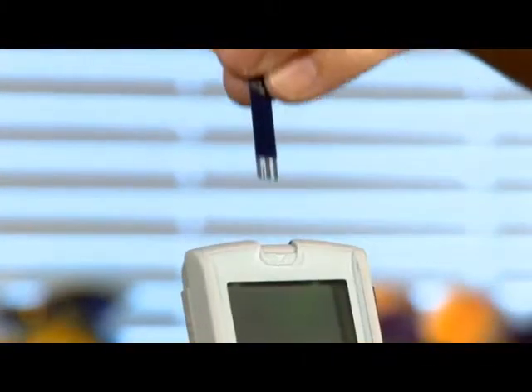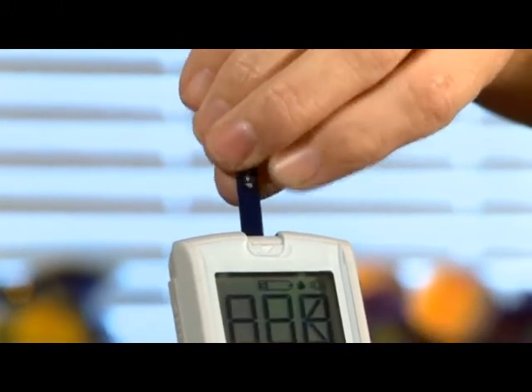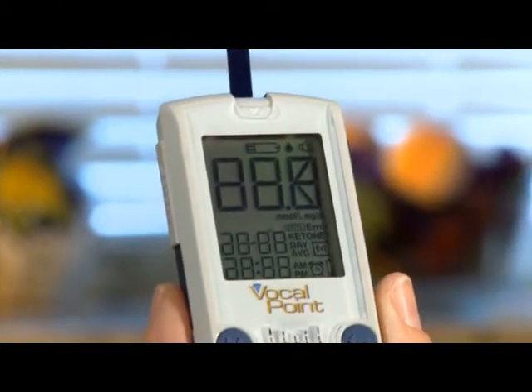Start by placing a new test strip into the meter with the black side facing up. This will turn on the meter.